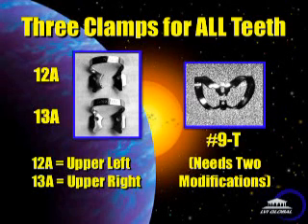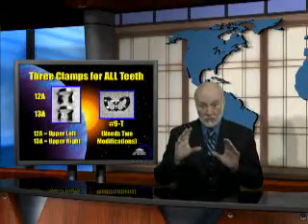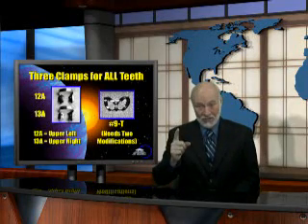Basically, you only need two clamps in the molar region and one clamp for the anteriors and bicuspids. The 12A is designed for the upper left and lower right. The 13A is for the upper right and lower left. The small jaw goes to the lingual on the upper for the single root, but if you get them backwards, it doesn't really matter. The 9T is used on all anteriors and all bicuspids, and I'm going to show you how to modify that clamp right now so that you can put it on molars as well. So technically, you might only need one clamp.